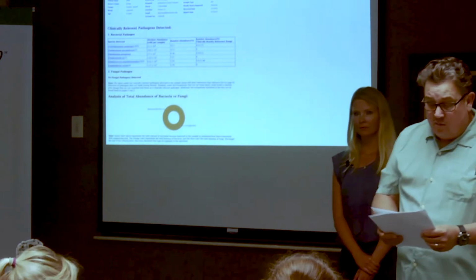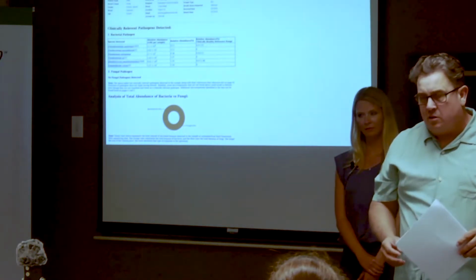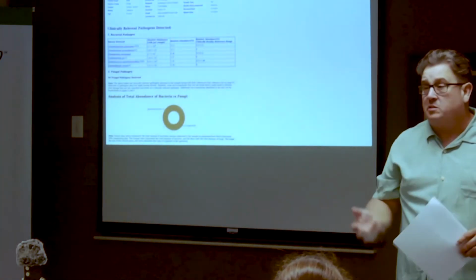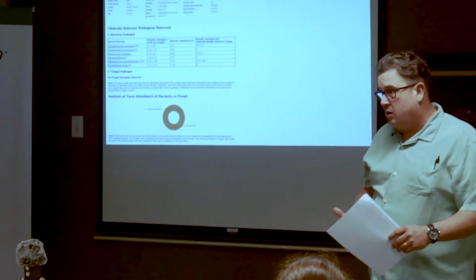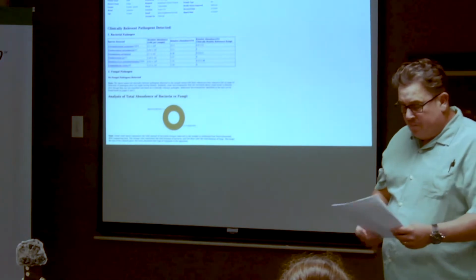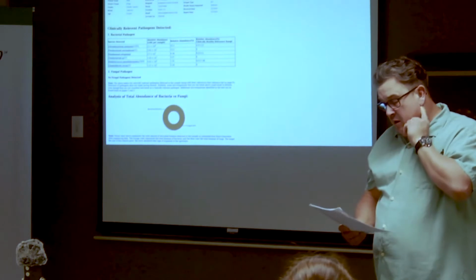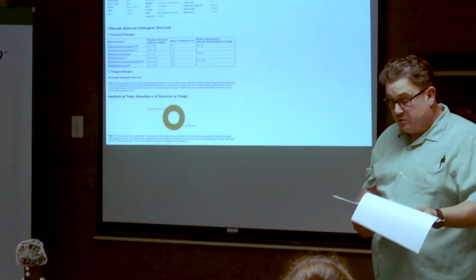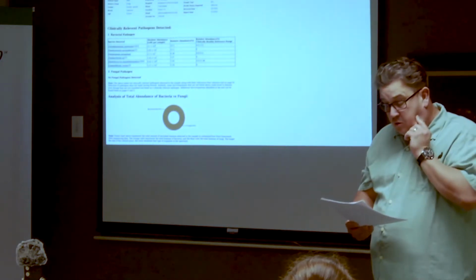Abby is an 8-year-old female spayed dog that came from the shelter, and the owners adopted her 3 weeks before bringing her into me. She came in with pus coming out of her ears and a big mass in one ear, and it was mainly infection in the mass. So I both cultured it and sequenced it. Culture came back with Pseudomonas, just poured out Pseudomonas. It didn't have any staph in it at all. It was just all Pseudomonas.